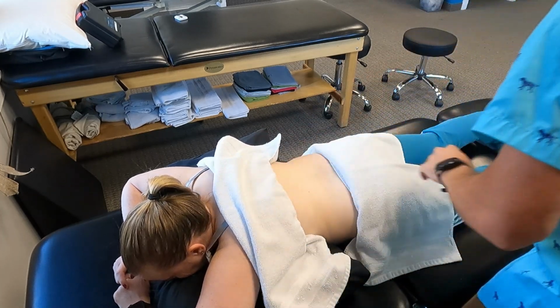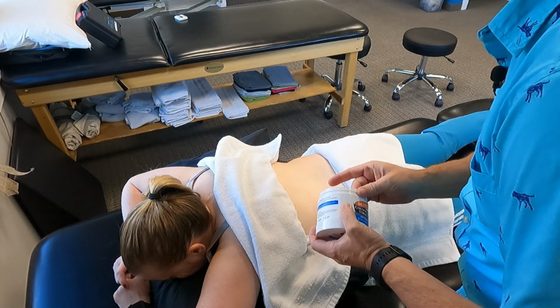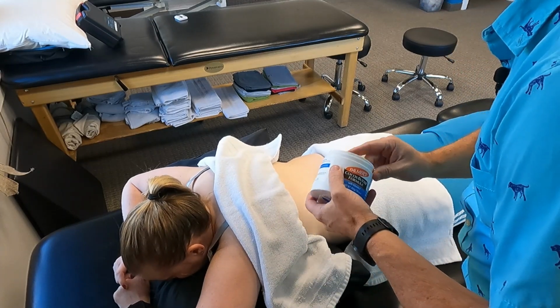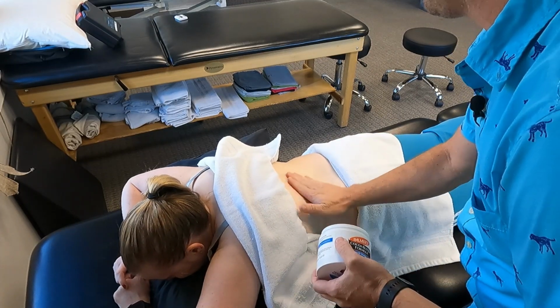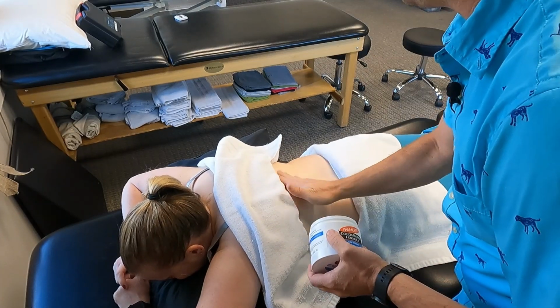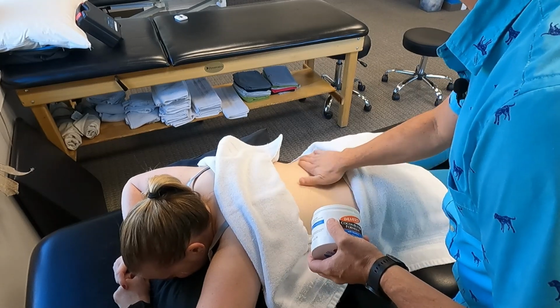So we're going to take some cocoa butter, put that on her skin. Those towels are to make sure we don't get cocoa butter on her clothes. She won't thank me for that. And I do work on both sides a little bit, so I'll put that on both sides.